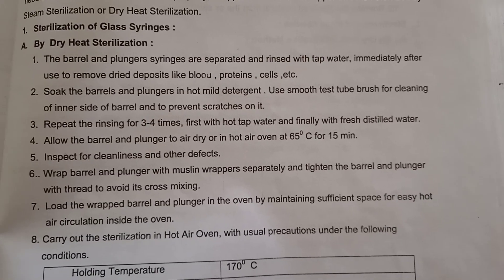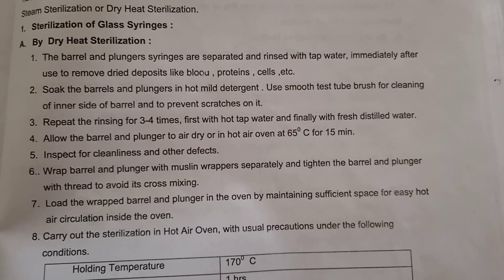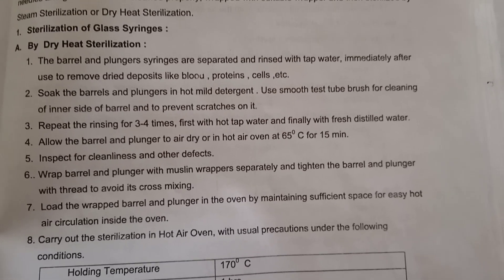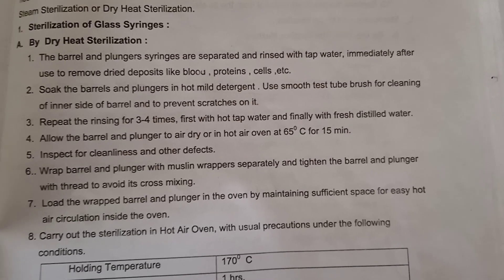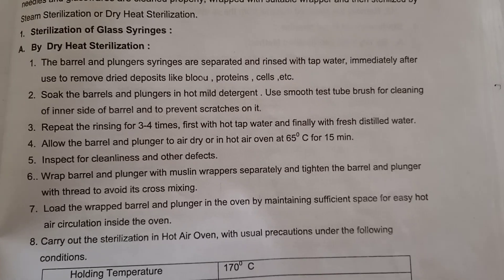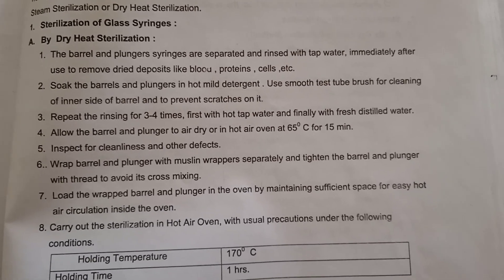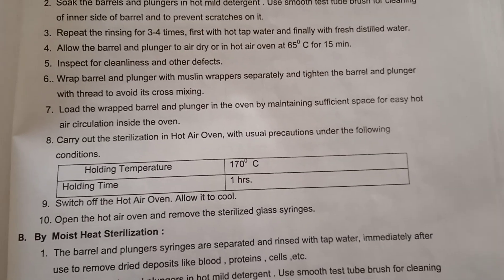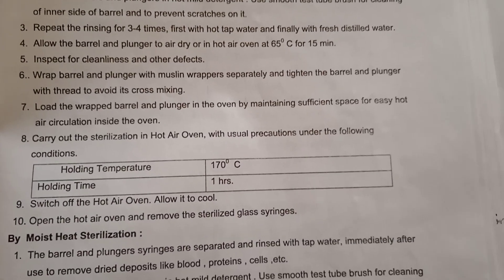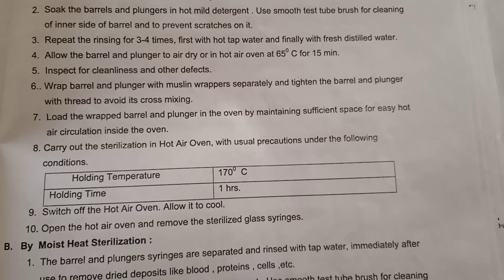Allow the barrel and plungers to air dry or dry in a hot air oven at 65 degrees Celsius for 15 minutes. After drying, inspect for cleanliness and other defects, checking whether any particles remain. After drying, wrap the barrel and plunger separately with muslin wrappers and tighten the barrel and plunger with thread to avoid cross mixing.